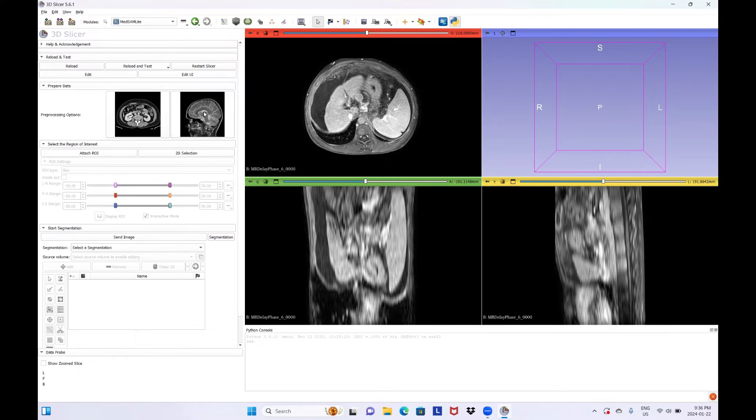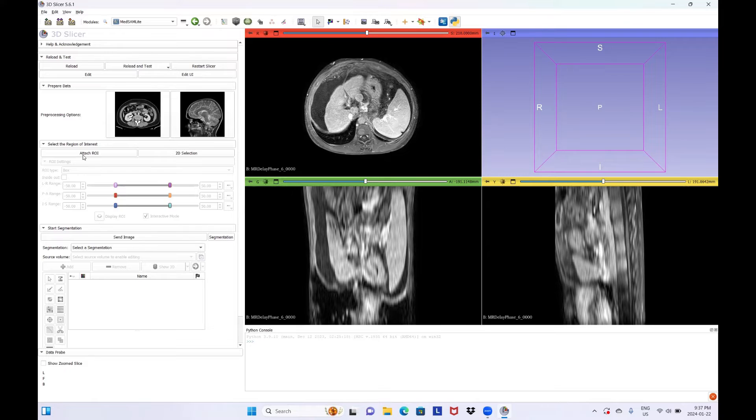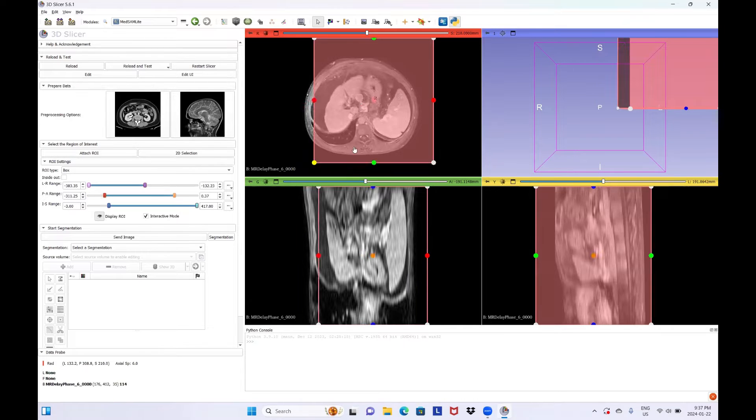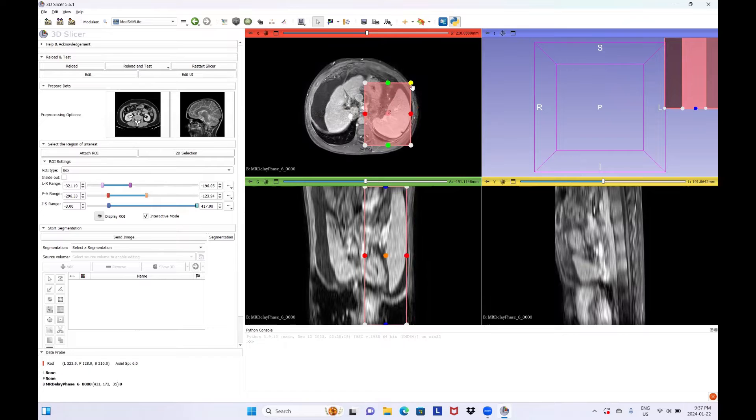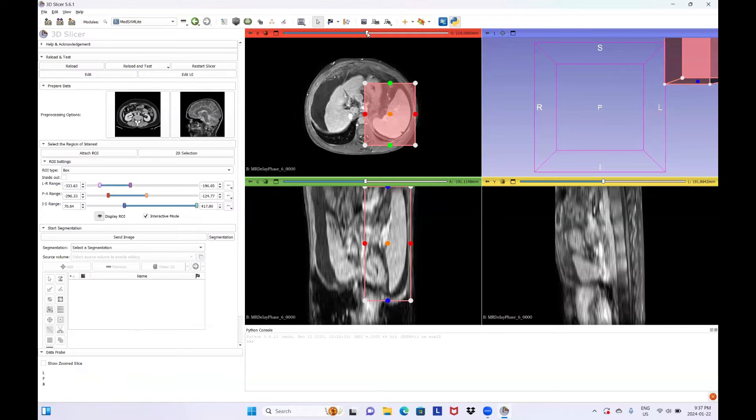From Select the Region of Interest Accordion menu, you can click on Attach ROI to select the region for segmentation. ROI defines the location needed for segmentation. You should make sure that the ROI covers all the region needed for segmentation.